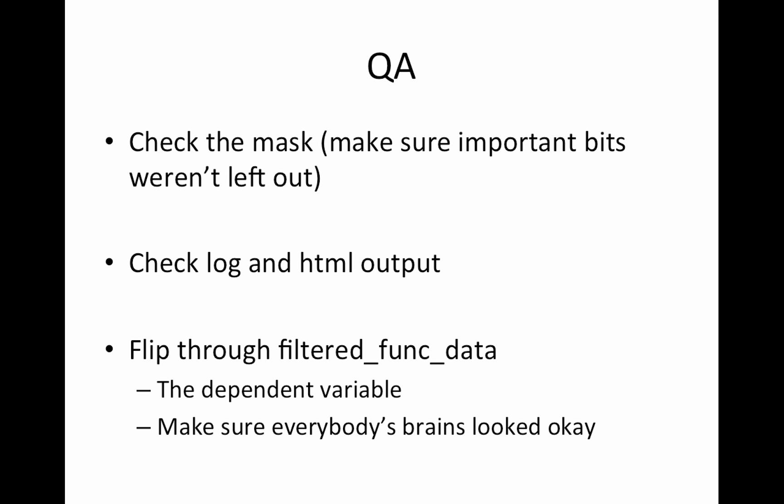So the QA step: one thing you want to do is check that your mask looks about right, look at your log and your HTML output to see what's there. I'll do a quick tour of that and then also flip through your filtered func data. It's always your dependent variable in the model, so you just want to make sure everybody's brain looks okay.